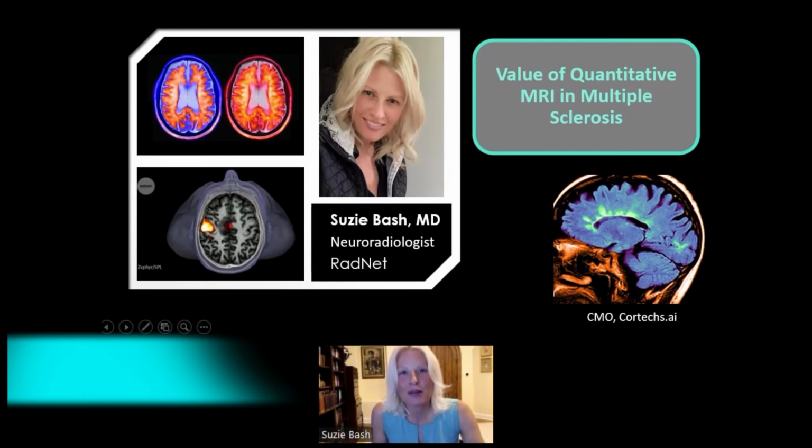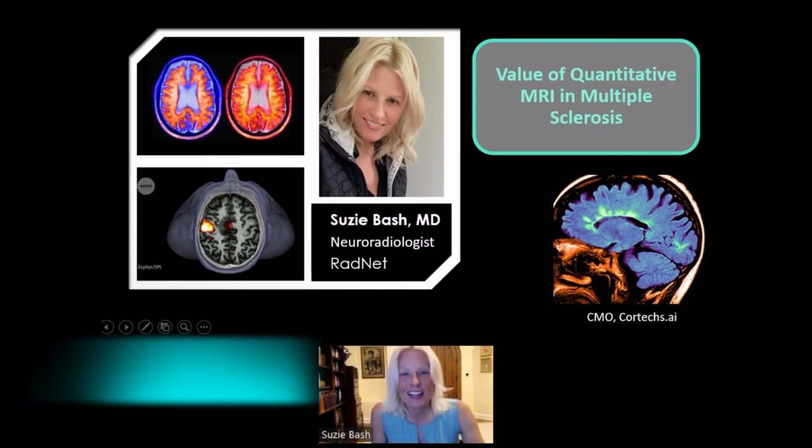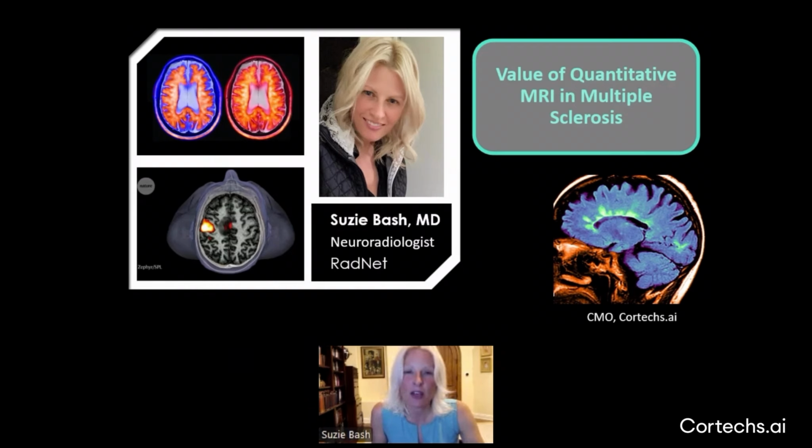My name is Suzie Bash. I'm a neuroradiologist at RadNet. Today, I'd like to talk to you about the value of quantitative MRI in evaluating patients with multiple sclerosis.